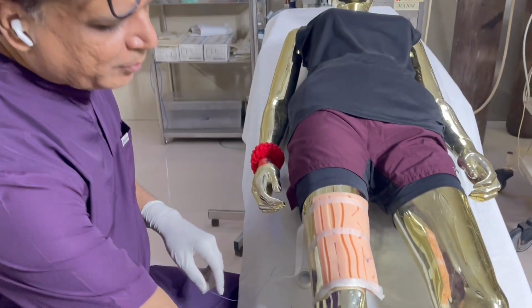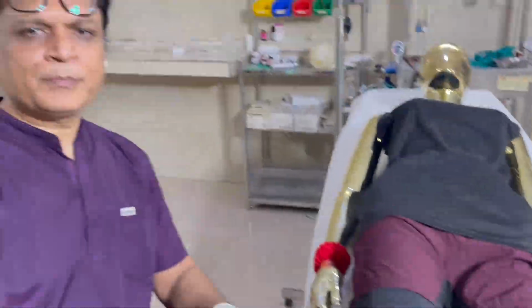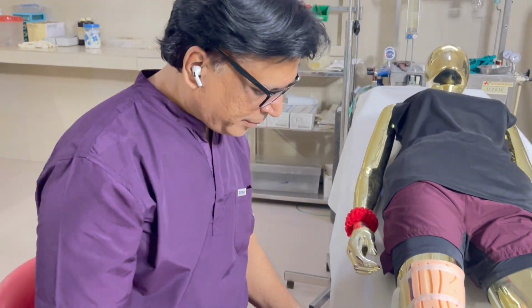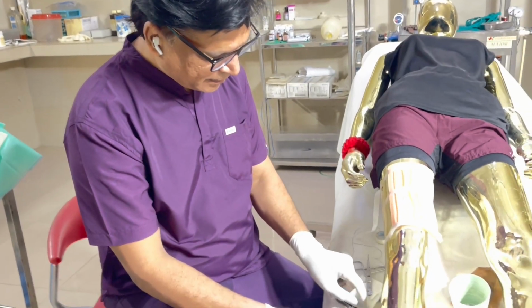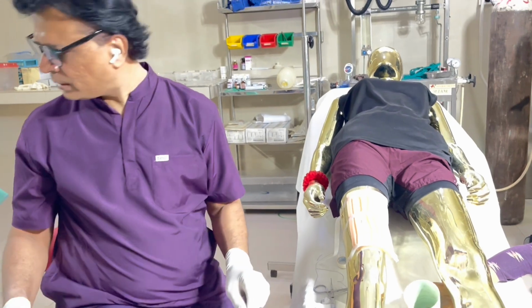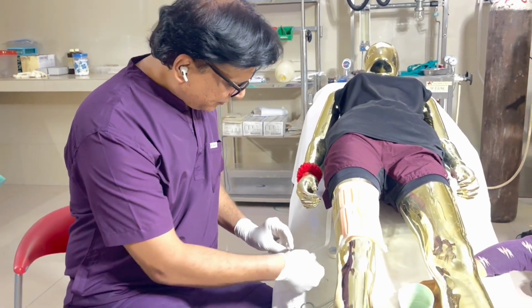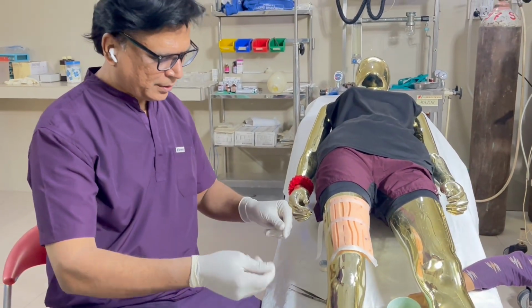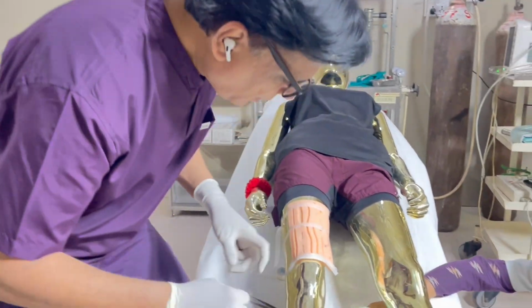So one more station is there where you have to suture. You have to suture inside the depth, and you can be given a simple suture like a silk. For example, this is the suture, and I have to put a simple suture around the vessel.